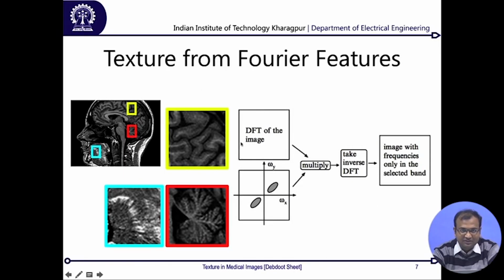Now from there, if you look into the DFT of each of these images, you can take small patches. That would effectively mean something equivalent to a short time Fourier transform. Over here it will just be a short length Fourier transform, or a patch-wise DFT as we call it, and then you can define different filters, which will just be some frequency band filters.